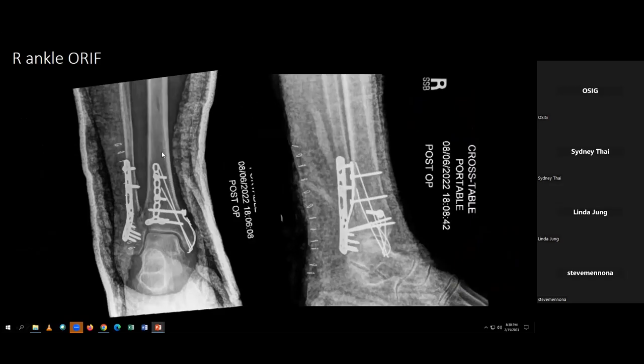So we actually had to do a posterolateral approach here and put a plate on the back. Did Lou do that one? You did, yeah. You can tell from the tension band. So what he's talking about is on the medial malleolus here, it's called a tension band construct. It's not like the 2 screws we saw earlier. It's like 2 pins that shoot across, and then a post screw, and then you take a wire and tie it around. It's just a different way to fix it.